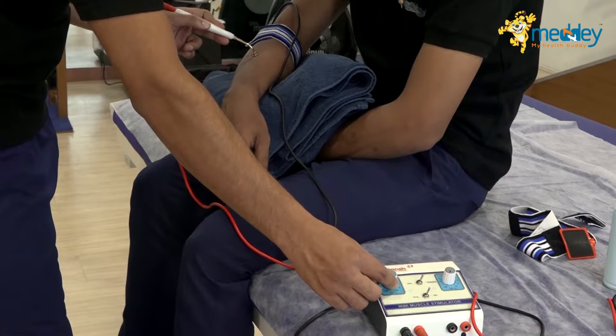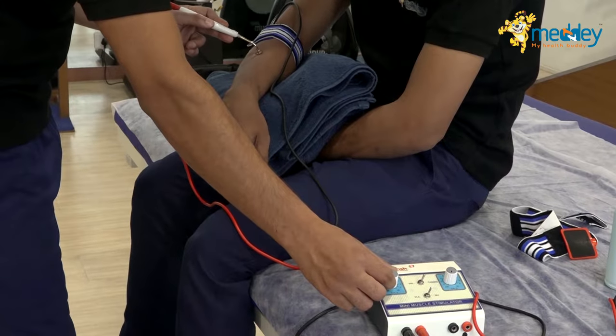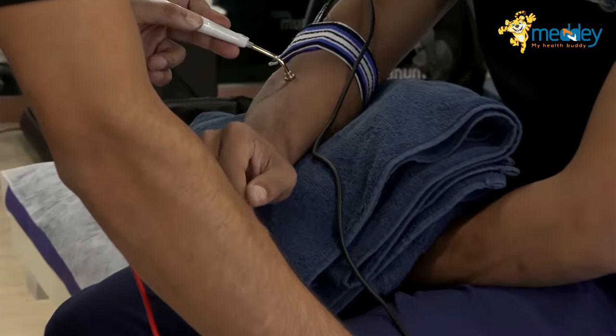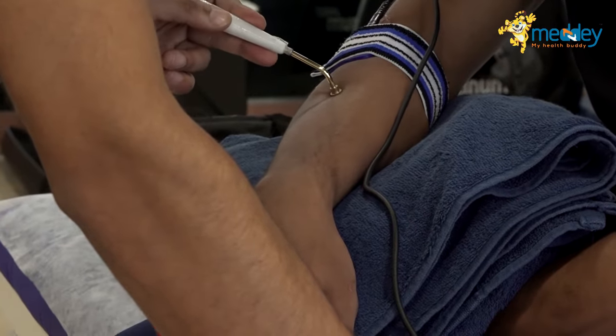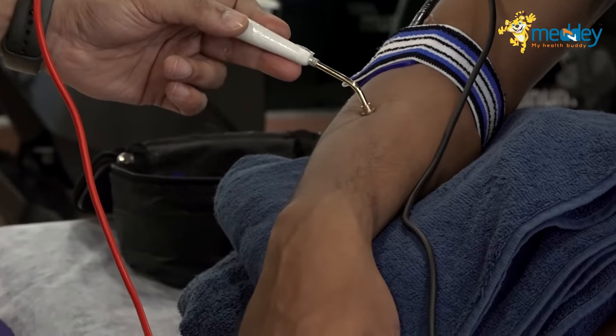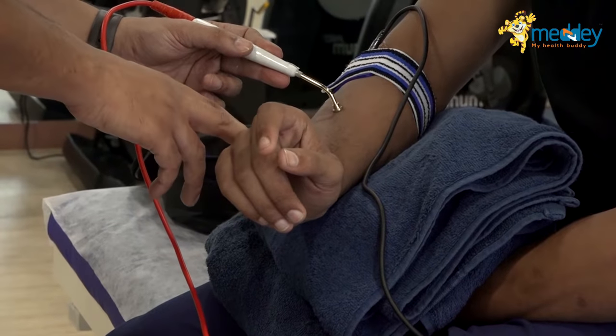I'm now increasing the current, and as you can see, I'm getting the desired amount of motor muscle contraction. This is wrist extension happening here.